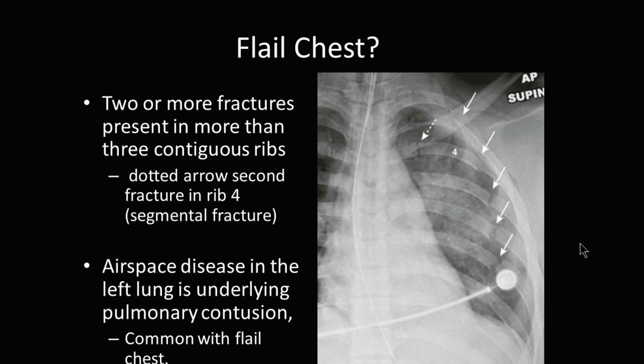We hear the term flail chest, and oftentimes we don't really know what that means. Depending on the definition that you read, typically it is two or more fractures present in more than three contiguous ribs. You can see here that there are multiple rib fractures coming down along this individual's left ribs. This rib right here has more than one fracture on the same rib. This is not a flail chest; however, it doesn't take away from the severity and pain of having multiple rib fractures.